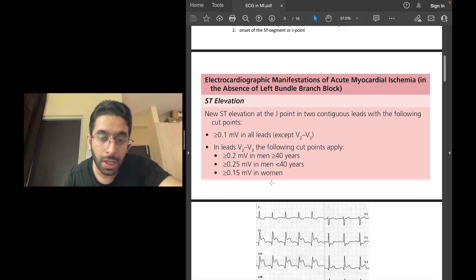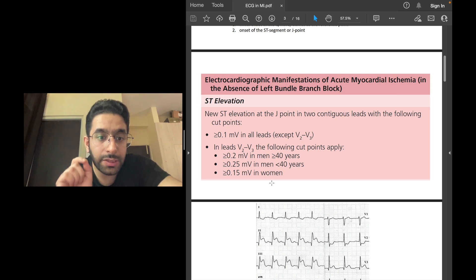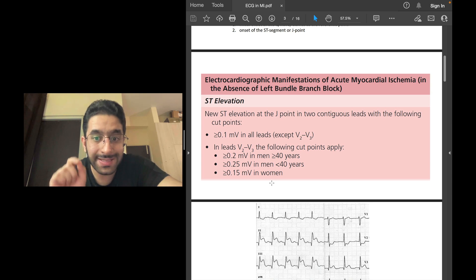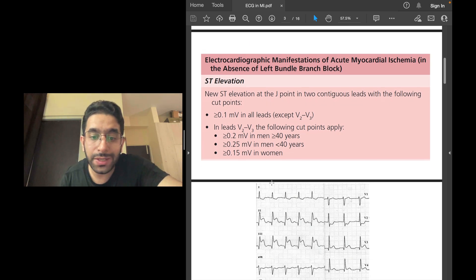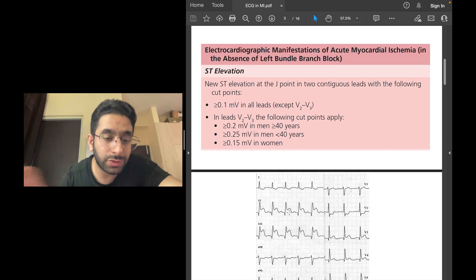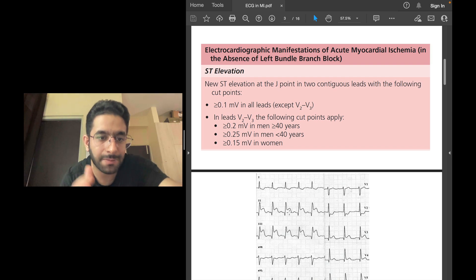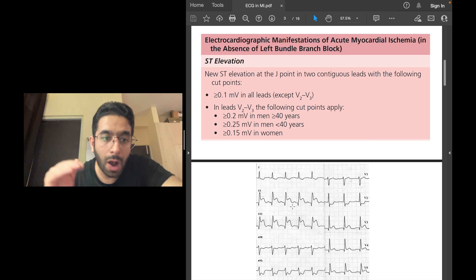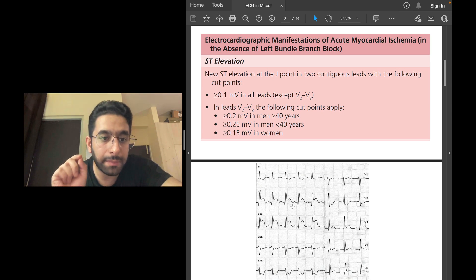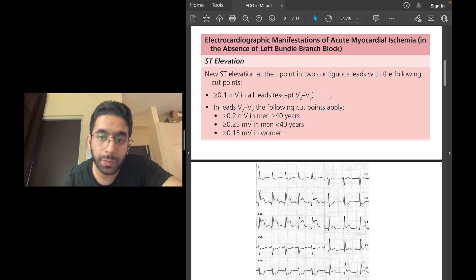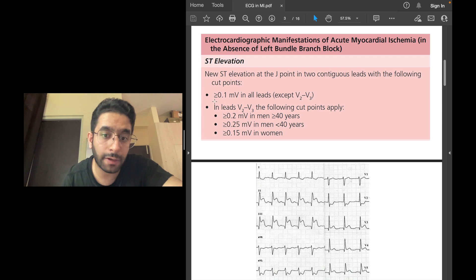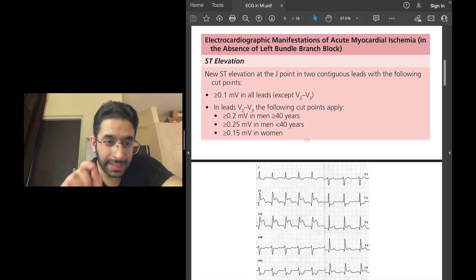To diagnose ST elevation MI, you need to detect new ST segment elevations at the J point in two contiguous leads — two adjacent leads. Leads 2, 3, and AVF are contiguous; leads V2, V3, V4 are contiguous. How elevated should the ST segment be? At least 1 millimeter (0.1 millivolts) in all leads except V2 and V3, which have different cutoffs.